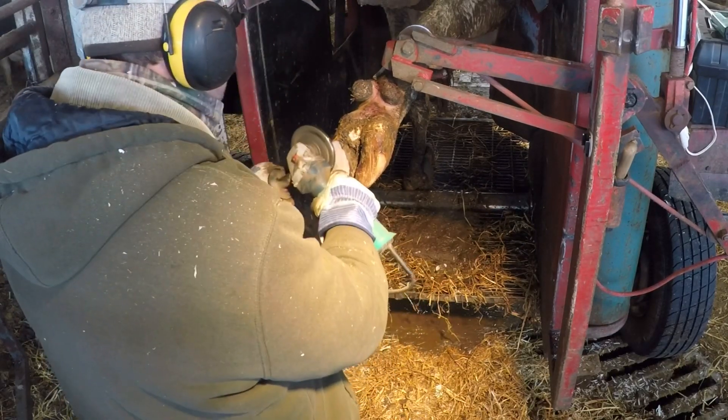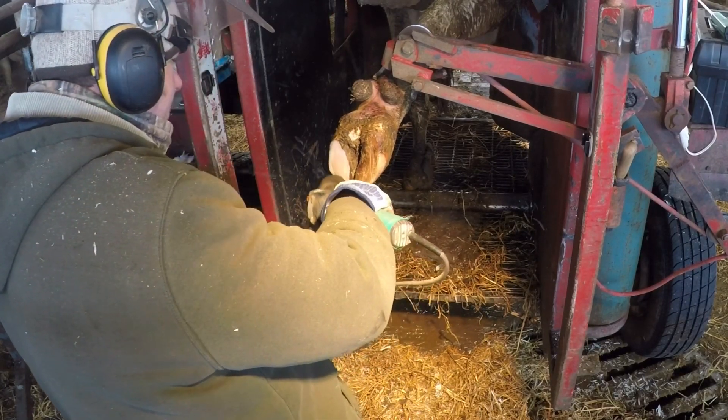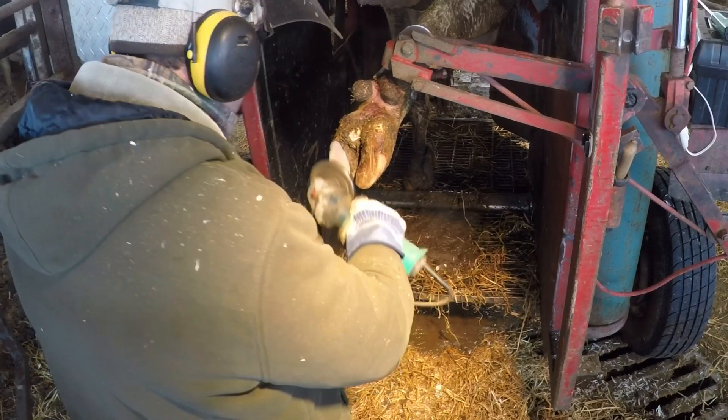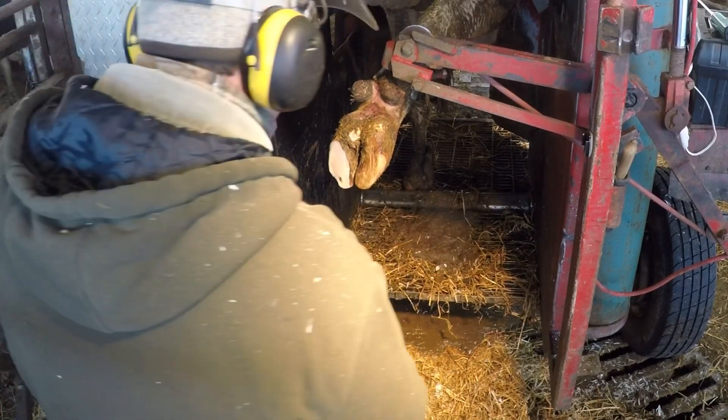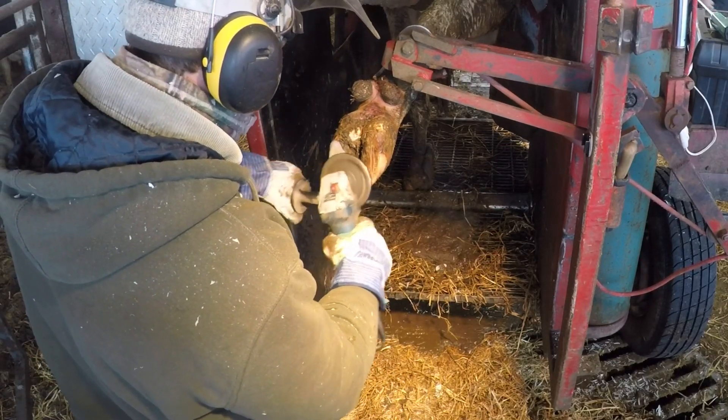Welcome back. On today's video, we're going to be looking at a cow named Candace. She's exhibiting some severe lameness and has an ulcer on the medial claw of her right rear foot. We're going to clean that up and apply a block to that lateral claw — that outside claw — to take the weight off and to elevate that medial claw to give it time to heal.